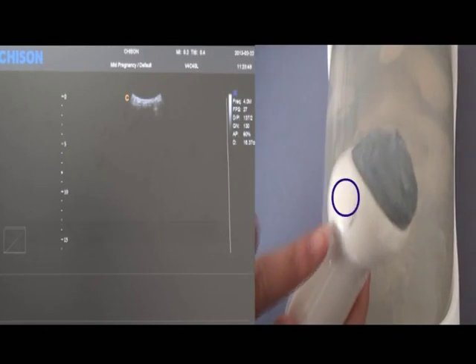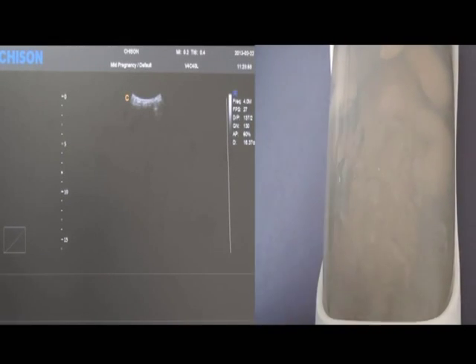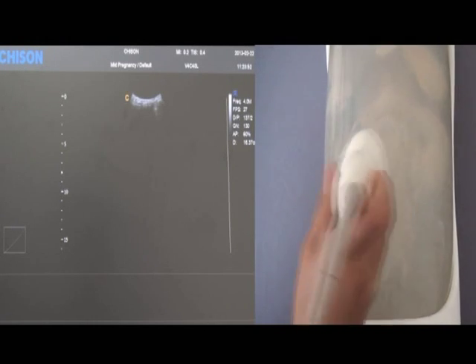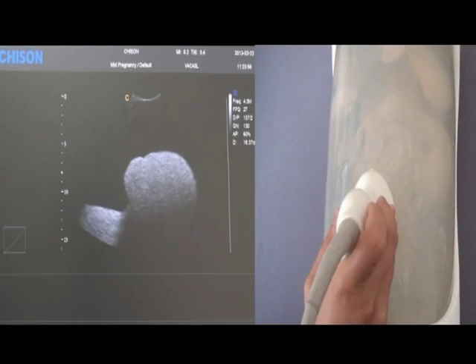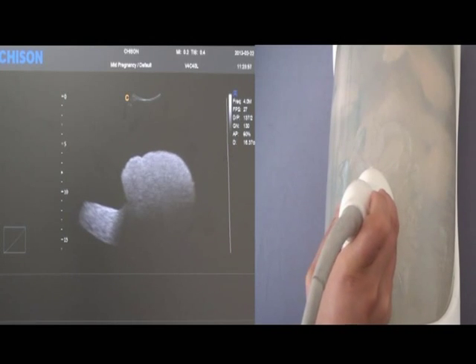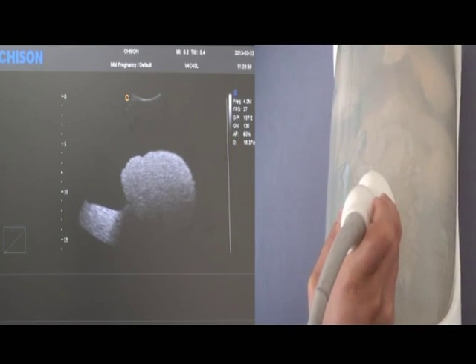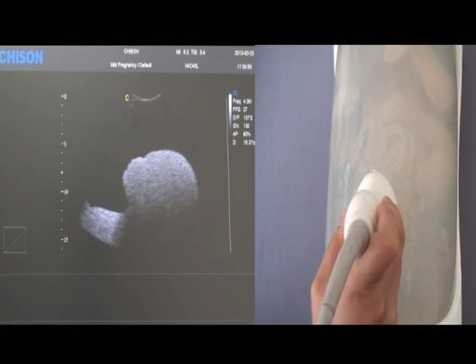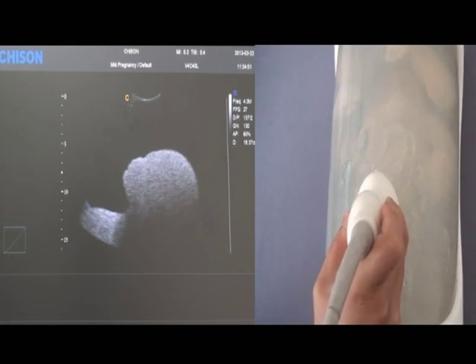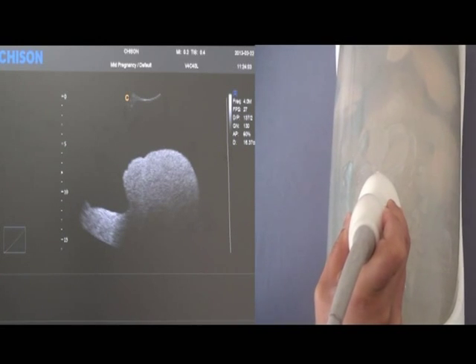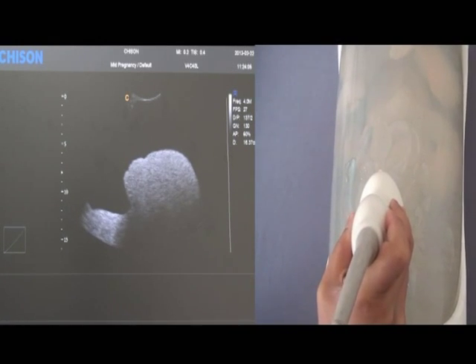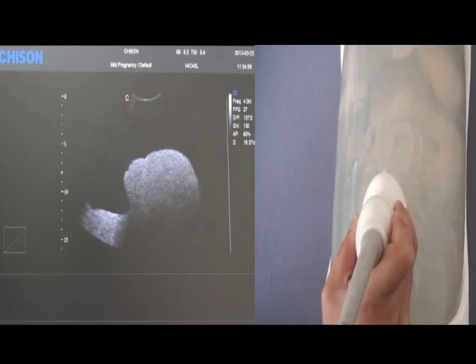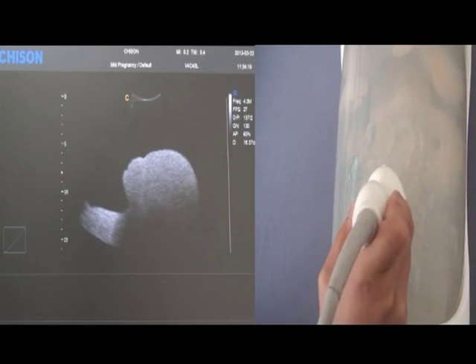Take the 4D probe, find the mark here, and point it to the patient's head side. Make sure that the fetus head is on the right side of the screen. When you are in B mode, you will get the sagittal plane, coronal plane, and axial plane. The best plane to get a good 4D image is the sagittal plane, so you need to find the sagittal plane like this image.